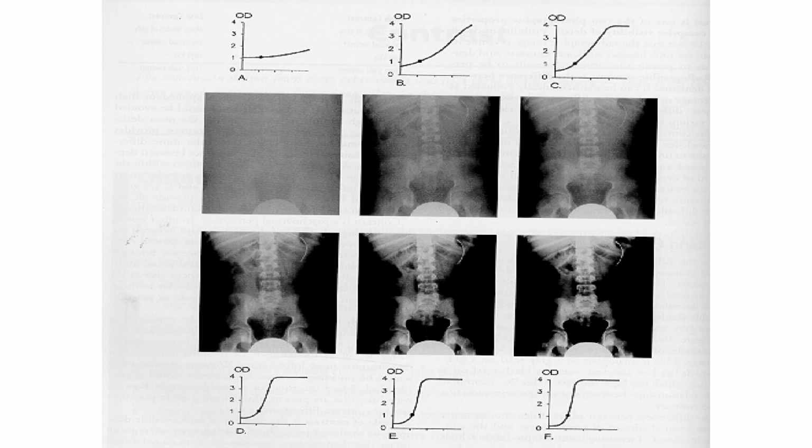Di ba? You can see the lumbosacral vertebrae plus a portion of the coccyx. Then you can also see the ribs. Di ba? The floating ribs. Ano pa nakikita? You can also see the hip joint.